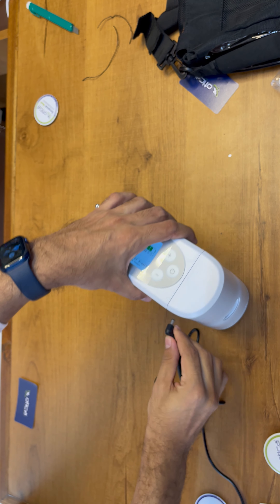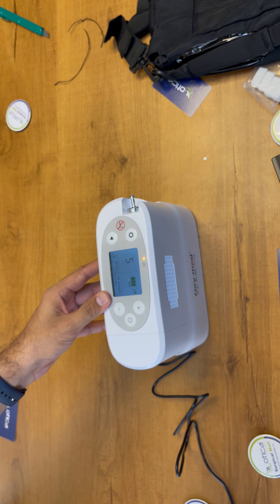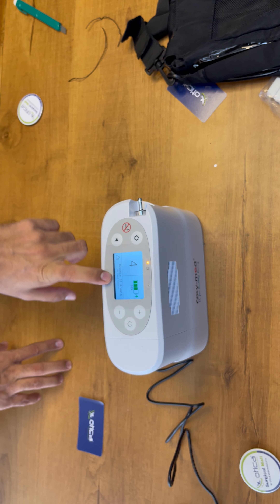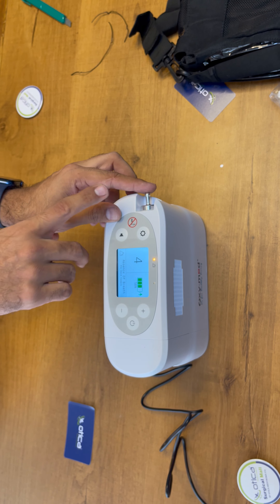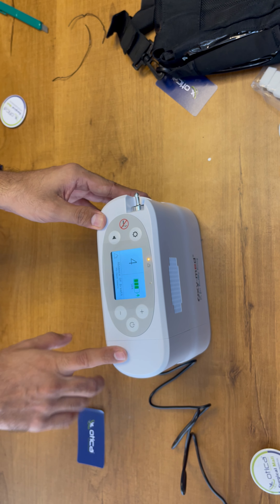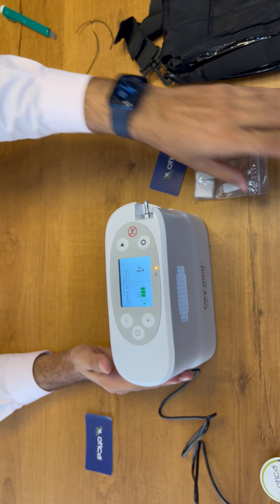We have connected the power cable — you can see the battery will start charging when we switch on. The symbol of power here means the battery is getting charged. There is still an alarm indicating absence of breath, but whenever you connect the nasal cannula and someone is there to breathe, the alarm will go away. You can see the machine is being used along with the charger — so you can use this device while charging, whether in the car with the car charger or at home.